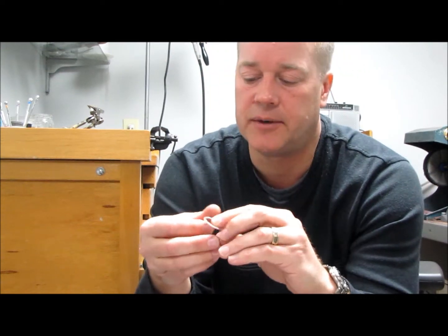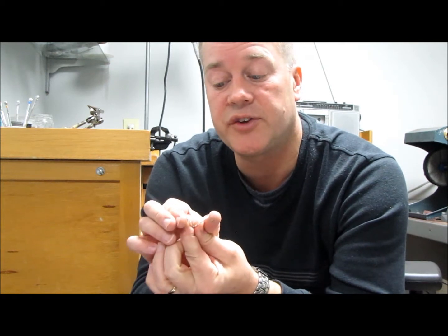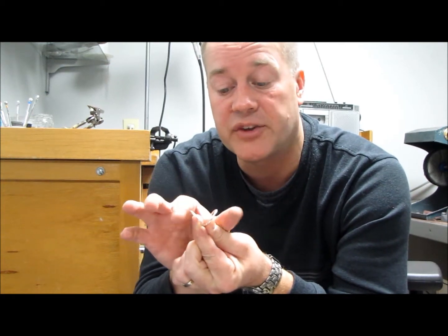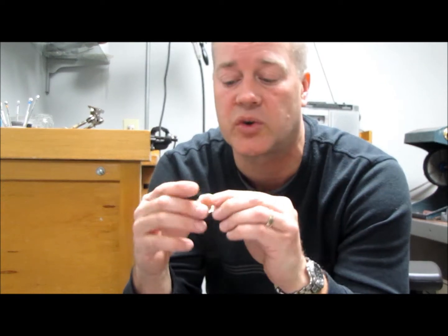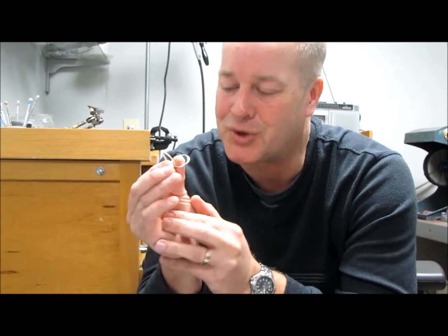If it's a hot end of July day where it's really muggy and your fingers are a little bit thicker, you can take the rings and squeeze them closer together. That's the nice thing about silver. By squeezing them closer together, you loosen the fit. But say it's a January or February day where it's cold and they're loose, because we tend to thin up a little when it's cold, you can take the rings and spread them apart. So they're malleable, they're adjustable, they don't look terrible.